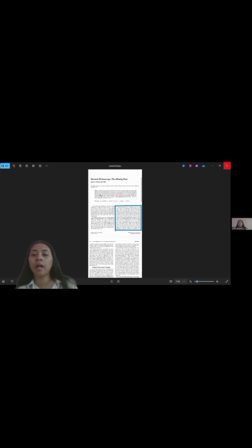And the result or the observation is that in normal lag of accommodation, the focus is about plus 0.25 diopter to plus 0.75 diopter. Too much lag suggests poor focusing ability or a fatigued eye.